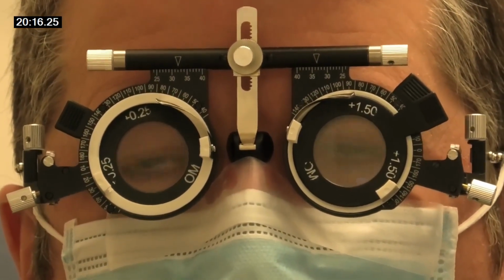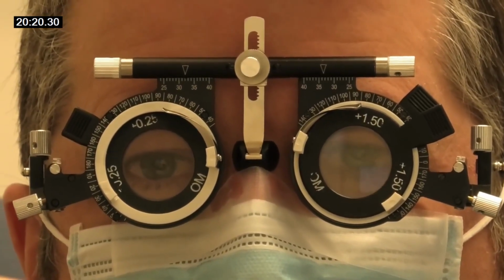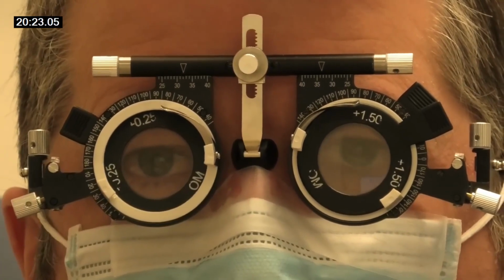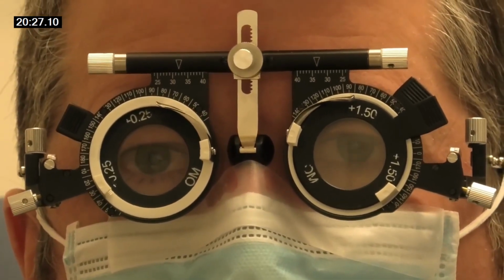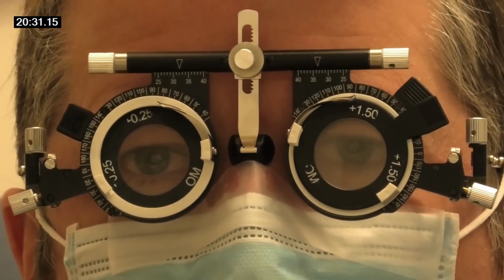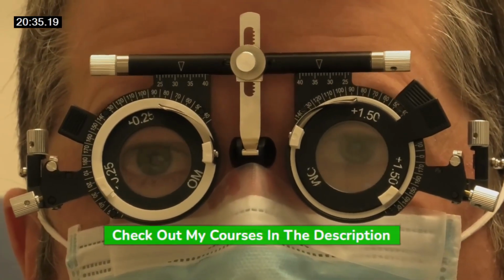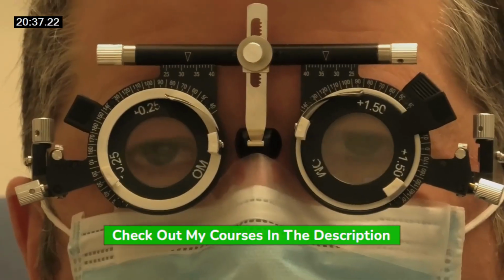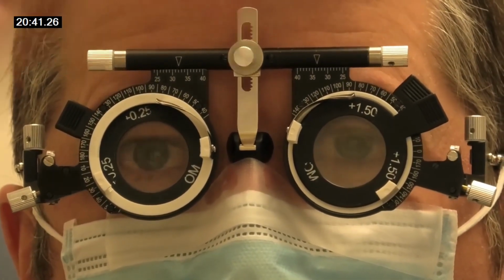Okay. So in this phase, I suppose we could use the halves, which is the yellow one, or we could use the blue one. Let's do the blue because it's a tricky one. So we want to see what happens if we put +0.25 in. Does it stay the same, or does it get worse? Because it's not going to get better. It's just going to get worse or be the same, basically. So if it's the same, we go up in power.